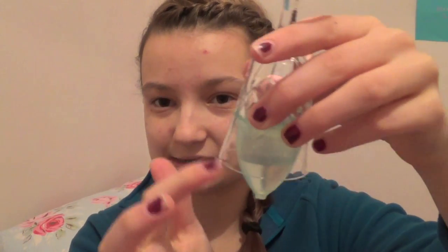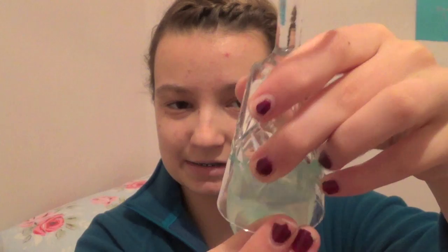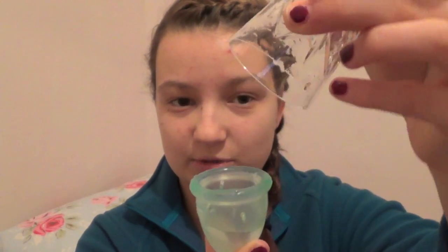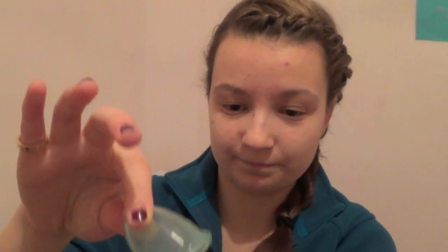And those holes, they just help it to open up, which is actually tip number 2, I have to say. This is going to drip a little bit when I open it up because, as I said, inside your vagina your muscles will be hugging this, so it won't leak, but there's this great bit of air gap here. But the way you open this is simply punch down and slide this together. We didn't drip too much actually, pretty good. So there is your cup, and it's still holding the menstrual fluid.